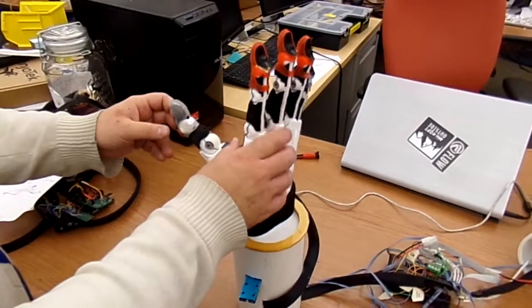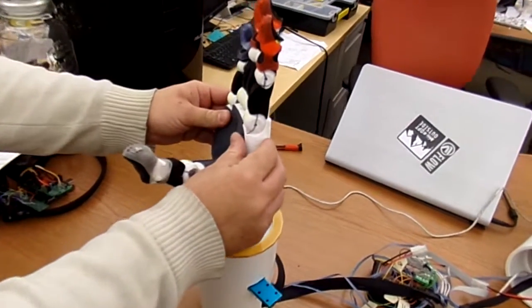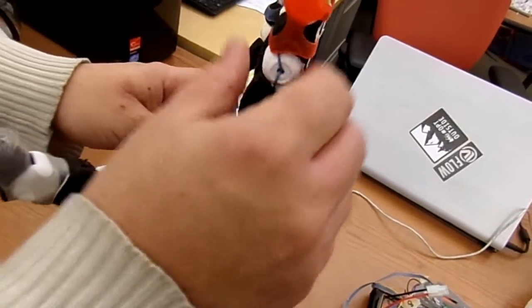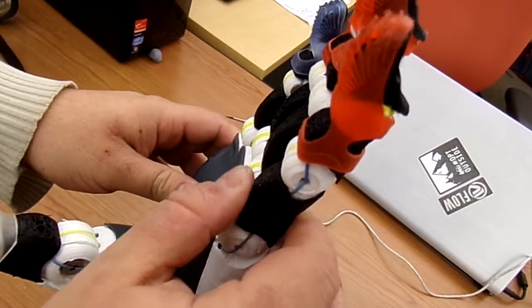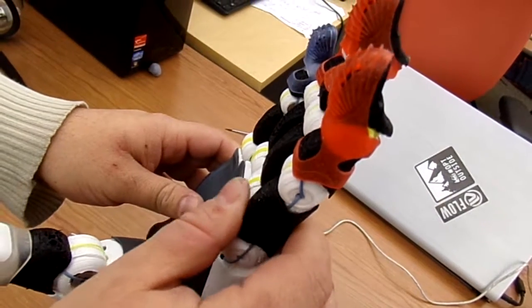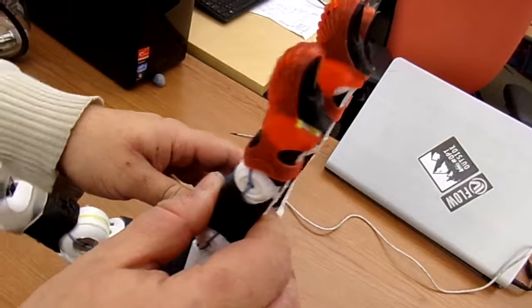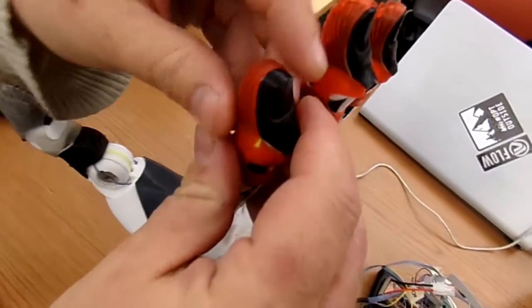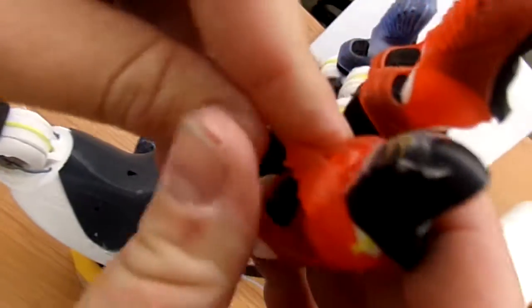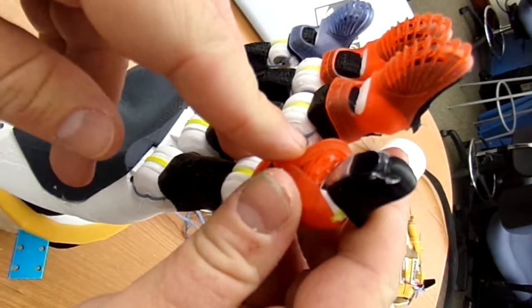So this is our ipsilateral hand. It is made of PLA for the main body of the hand. The fingertips and the finger pads are made of TPU, which allows for soft grasping of objects. At the very tip of the fingertip are rubber pads, which hide force sensors, which allow for feedback in the contralateral hand.